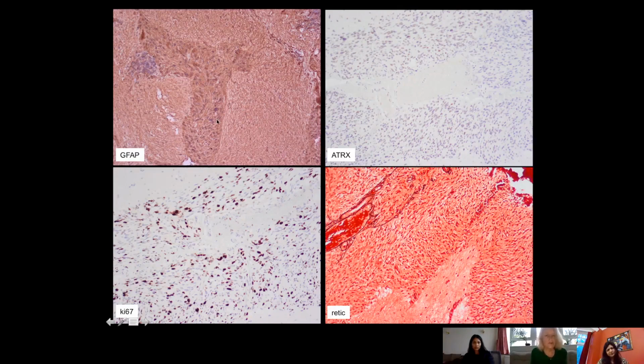So immunohistochemistry here, GFAP confirms the glial nature of this tumor. ATRX, and I'll tell you shortly why I performed ATRX here, is weak, but it appears retained in the majority of tumor cells. And there is a significant increase in proliferating rate.